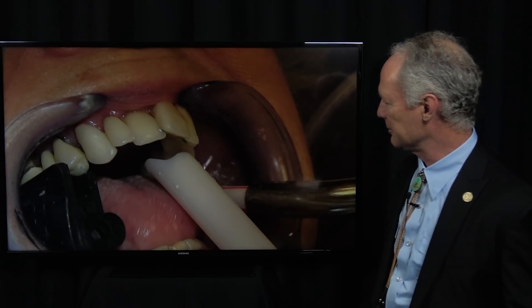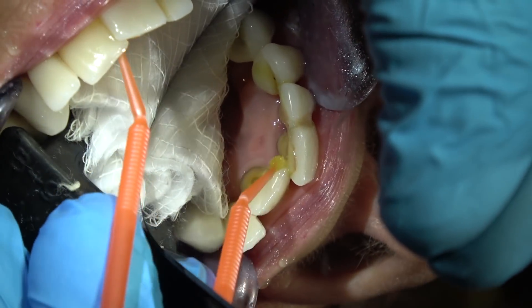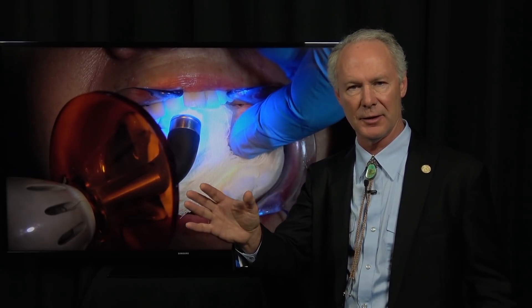Then I'm going to rinse it off. I want the teeth to be wet before placing the primer adhesive, because it enhances the hybrid layer if there is any exposed dentin. This is primer adhesive. Be sure you blow all the primer adhesive off onto a 2x2 — don't leave it wet on the teeth.